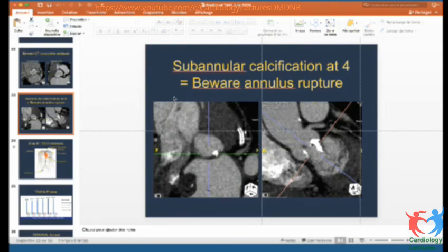So coming back to Dr. Sathimurthy's question on detection of bicuspid valves, I think if you use a transthoracic echo, your sensitivity is as low as 60%. So you need a modality like CT or a transesophageal echo to diagnose bicuspid valves. Yes, you need CT always before proceeding for a TAVI procedure. Always, because you have to check perpendicularity.